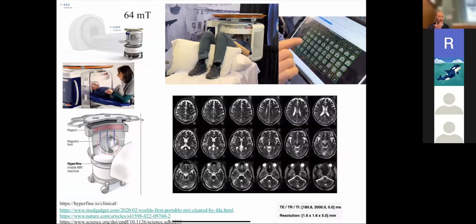And so one of the questions is, is there a place for these in the healthcare system? Do you always need the best magnet possible? If you're at an academic center like UCSD, we always want the best, right? Our radiologists will always want the best equipment so they can make the diagnosis of even the most rare case. And that's great. But if you're in a country that may not have much infrastructure, then there might be an advantage to having these good enough magnets spread out across the community.